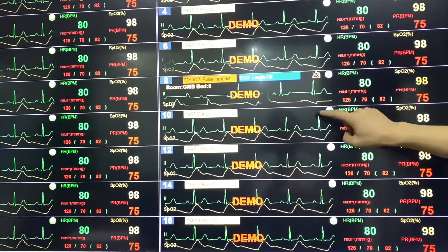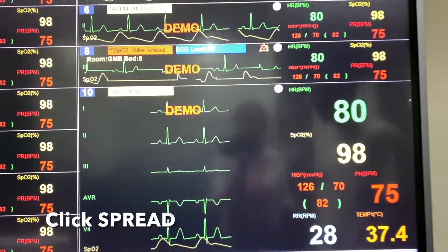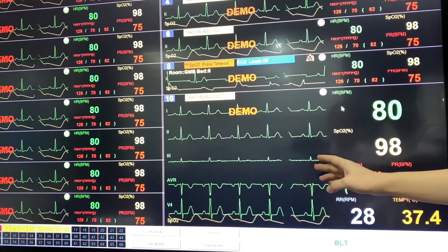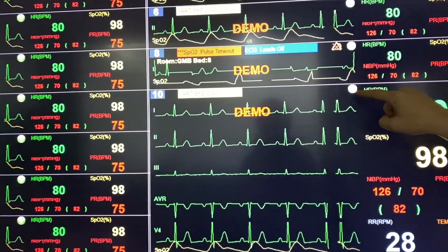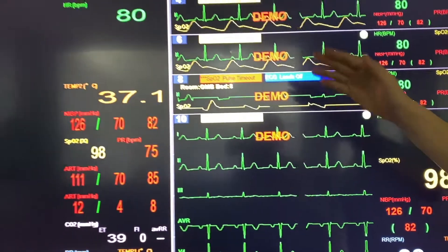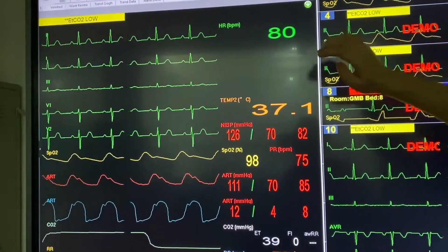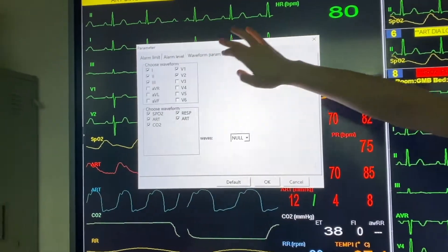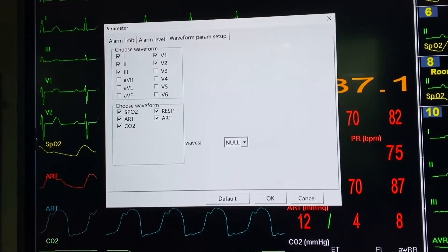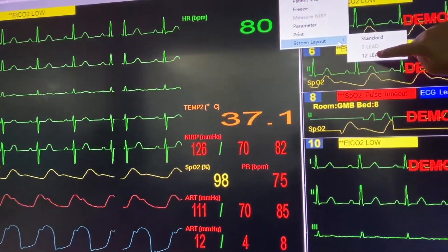If we want to focus on individual patients, we can click onto the arrow here to expand the individual patient's waveform. So in total on the screen at the same time we will be able to see six waveforms. If we want to see more waveforms, we can select 'view bed' and we will be able to see 10 waveforms at the same time. We can also customize individual waveforms depending on users' needs and select the relevant waveforms, including all 12-lead waveforms.